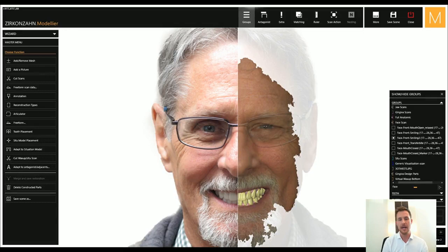Okay, so let's start with the actual case I want to show you, with just a little information beforehand to understand the whole workflow. Let's start with this situation here. This is a patient case I did together with Holger Meiser from America.